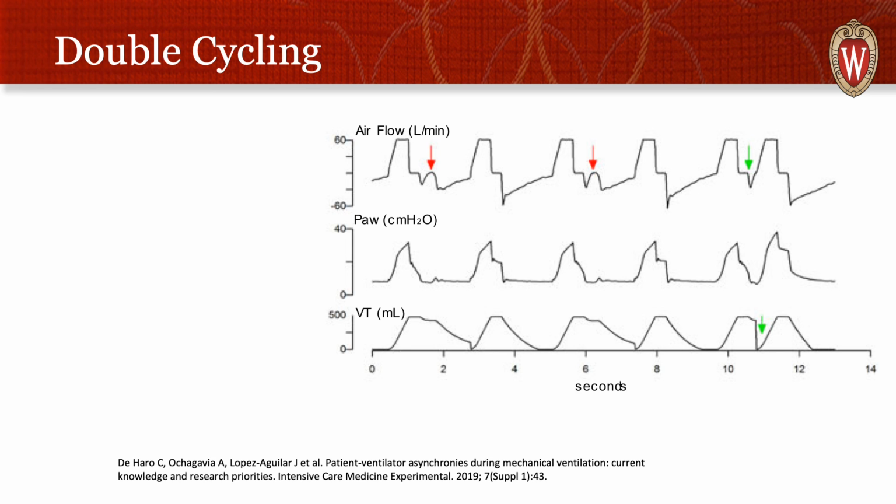And as we look, we see that after the first and third breaths, the patient has this unusual expiratory waveform where they thumbprint, or it almost looks like they try to suck in air in the middle of their exhalation. I call that thumbprinting. And this patient thumbprints breath 1, breath 3, and then on breath 5 you see that they finally successfully thumbprint enough where the flow moved positive to the flow trigger, and they get that second delivered breath. And you see on the pressure waveform, the pressure went up with a steeper slope, so this was a dangerous breath.